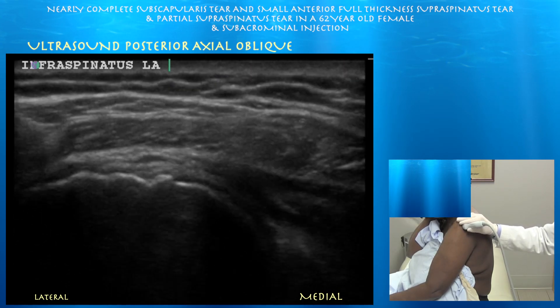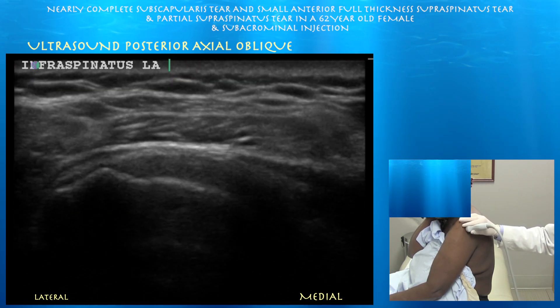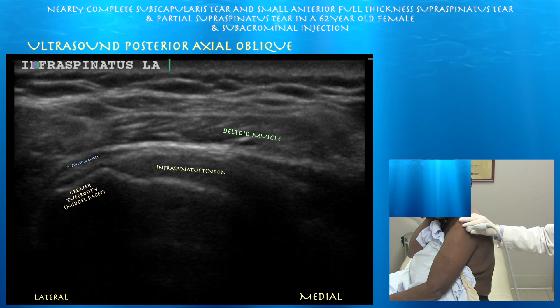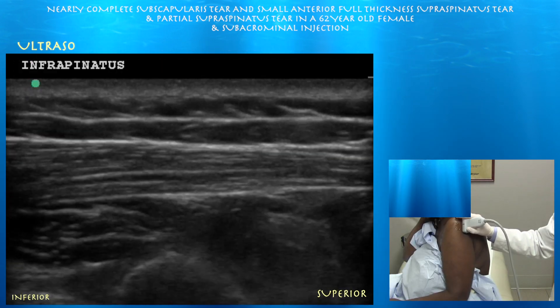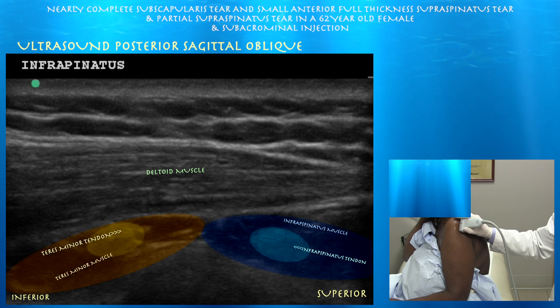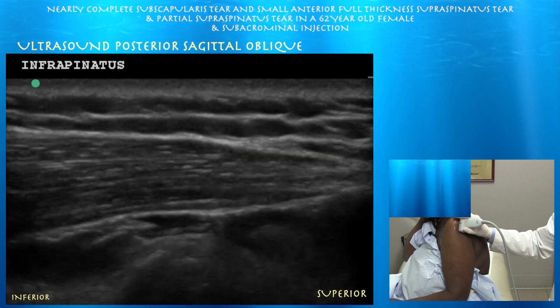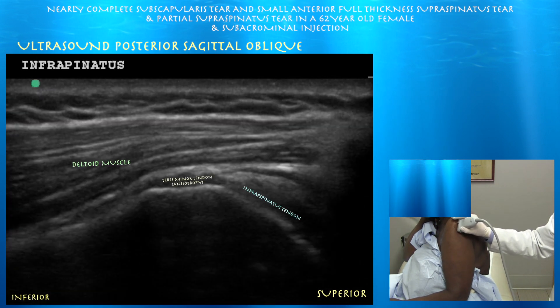At 1407 we're looking at the infraspinatus tendon, which looks okay. Right side of the screen is medial. Here's a fairly normal-looking infraspinatus tendon inserting on the middle facet of the greater tuberosity. Here's a short-axis view of the infraspinatus and teres minor. You can see the muscle with the tendon within the muscle at this point, along with the overlying deltoid muscle. As you go distal, you can see the muscle forming tendon. Generally the infraspinatus is about twice as big as the teres minor.